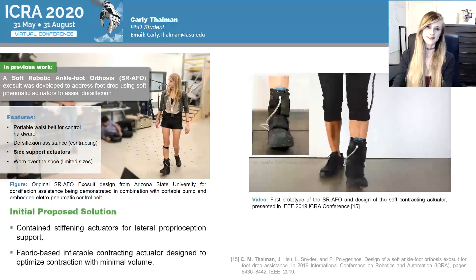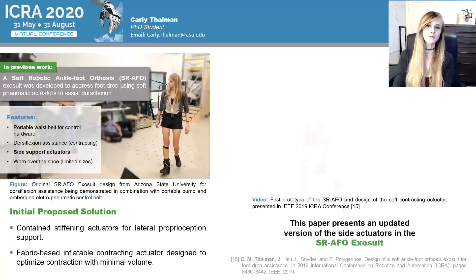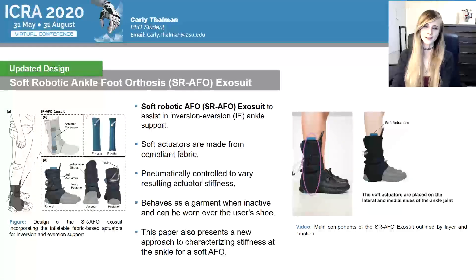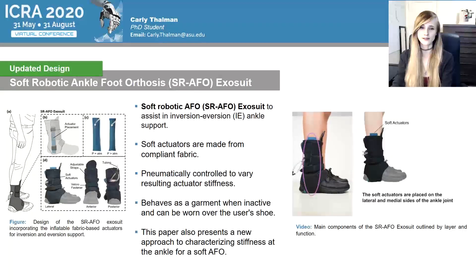This work also had preliminary investigation into using soft fabric-based actuators to provide lateral ankle support during the stance phase of walking. This work was presented originally last year at ICRA in 2019. In this work, we present our updated design for the SRAFO exosuit. It is designed to assist in inversion, eversion, or IE, ankle support using pneumatic soft fabric actuators to increase IE ankle stiffness with minimal impacts to ankle dorsiflexion, plantarflexion, or DP stiffness.